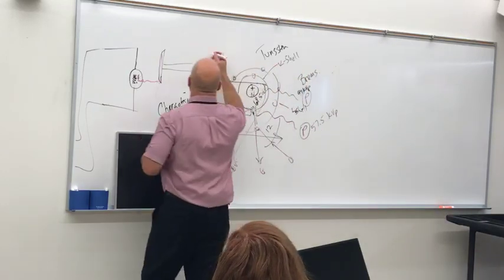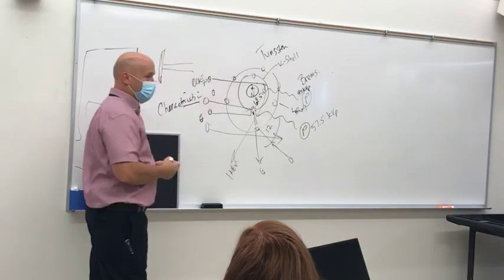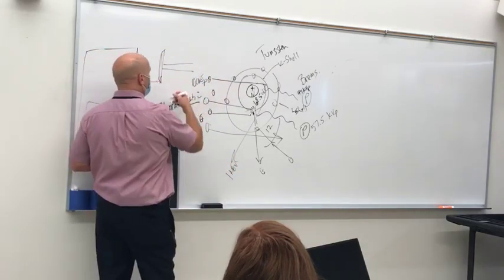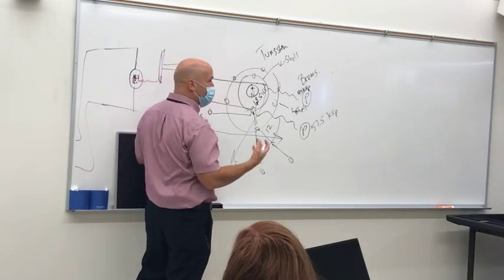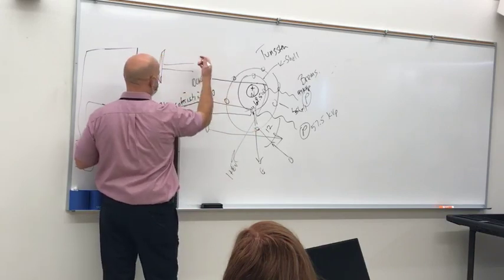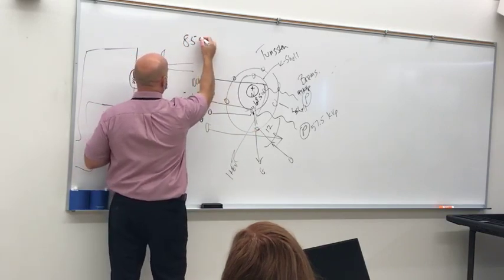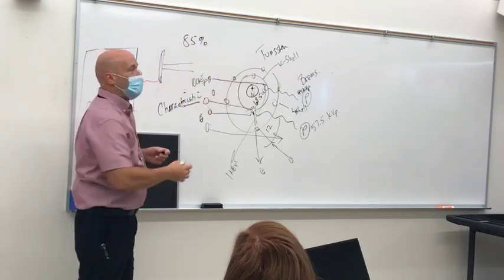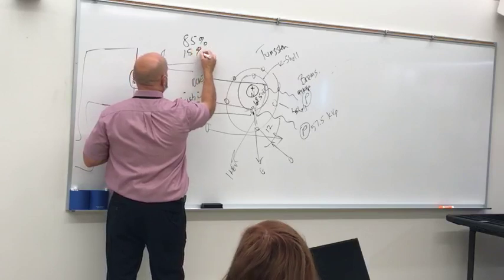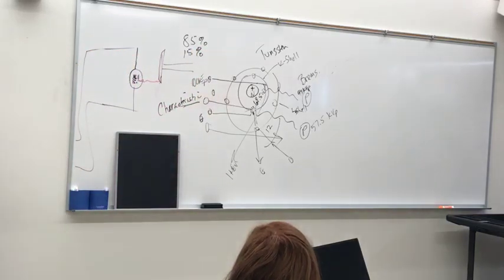So, statistically, according to Bushong, I think he's way off on this for reasons we'll talk about later in the semester. And it's not him that's way off; it's the science behind it. But my personal opinion is it's just not logical. Is that 85% of what we create are brems X-ray photons. 15% are characteristic photons. Okay?